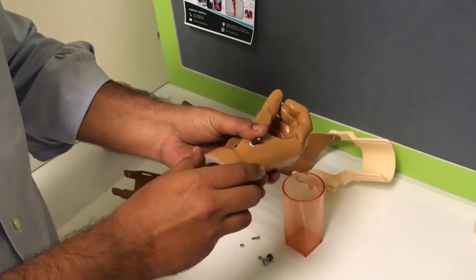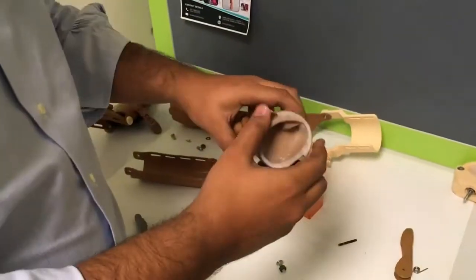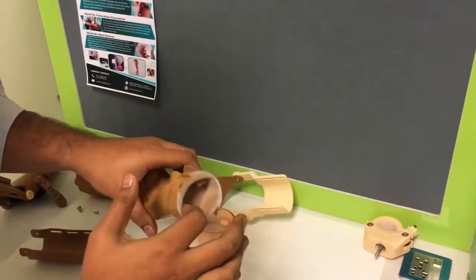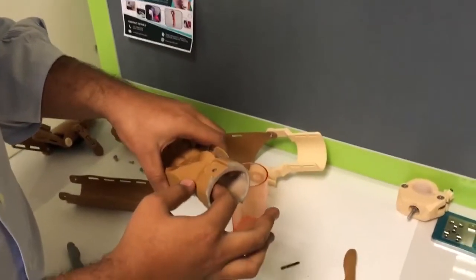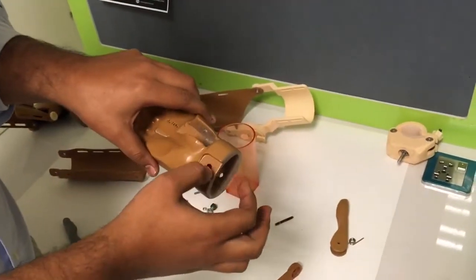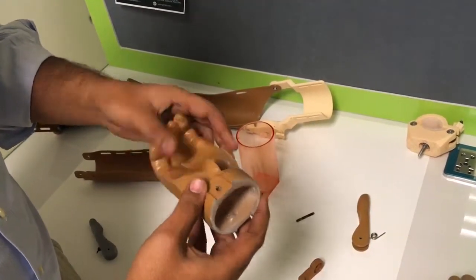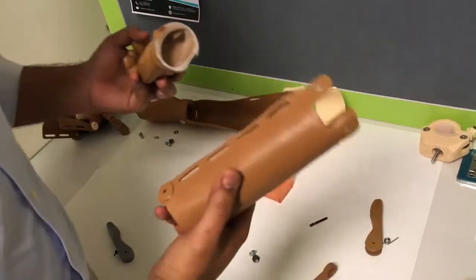We also modified the back of the palm. This is printed in one piece and you can see the plug over here — it has been modified from the original one. We have made these grooves to attach our forearm. Now let's come towards the forearm.